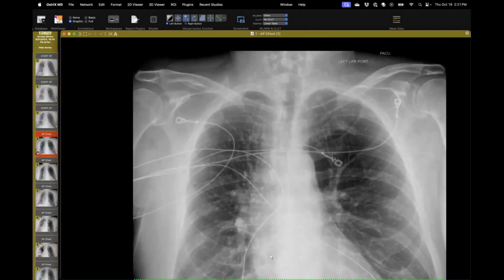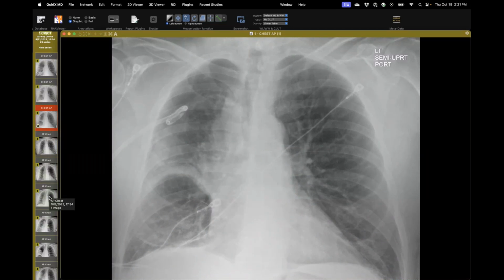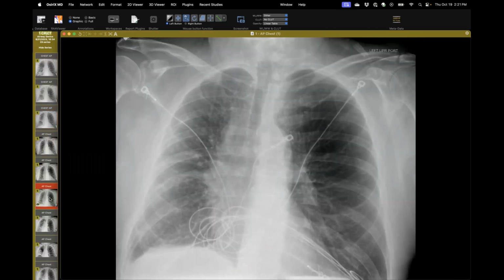One of the complications that occurs in these patients is they can get a pneumothorax afterwards from the rapid volume loss, and they can also get a post-obstructive pneumonia. This patient did fine immediately post-procedure. Then, in the next image, you can see he's starting to lose a little bit of volume here on the right. He is rotated, but it looked like it was starting to lose a little bit of volume.